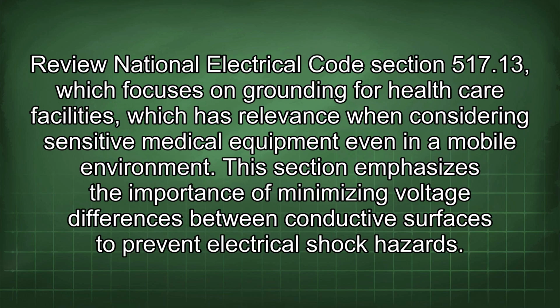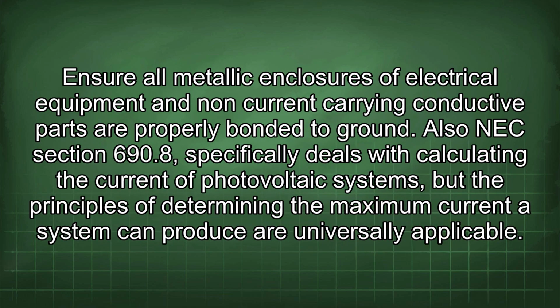Review National Electrical Code Section 517.13, which focuses on grounding for healthcare facilities, which has relevance when considering sensitive medical equipment even in a mobile environment. This section emphasizes the importance of minimizing voltage differences between conductive surfaces to prevent electrical shock hazards. Ensure all metallic enclosures of electrical equipment and non-current carrying conductive parts are properly bonded to ground.